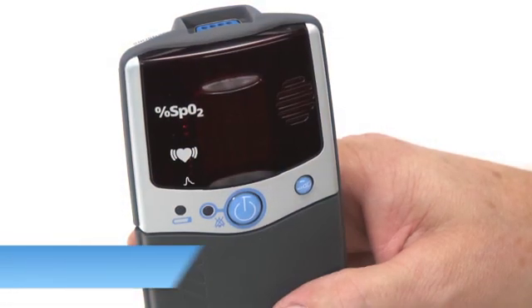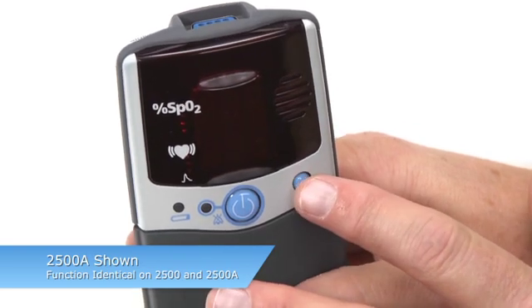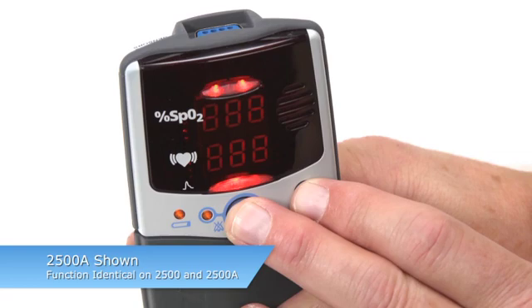To enter Setup Mode on the 2500 Model, start with the oximeter turned OFF. Press and hold the ON-OFF button and ADVANCE button, and while holding the ADVANCE button, then release the ON-OFF button.